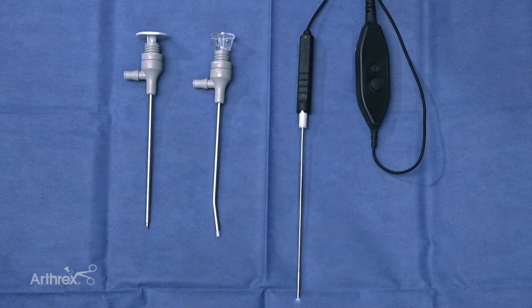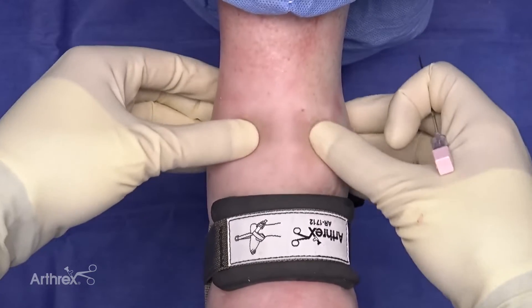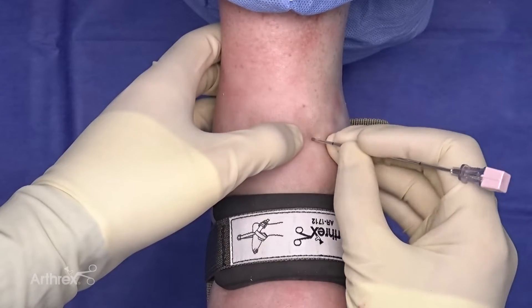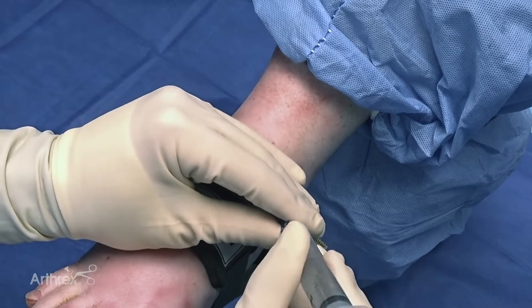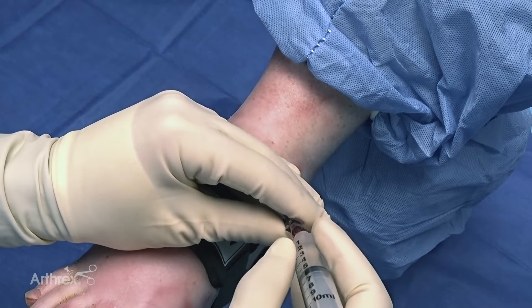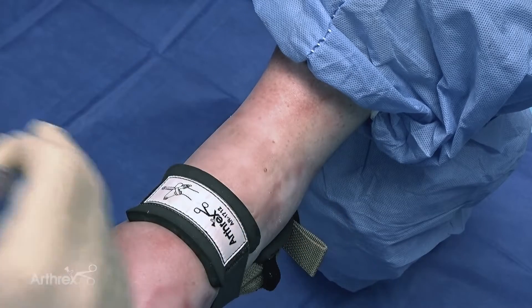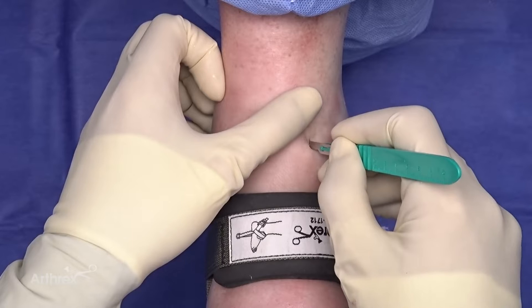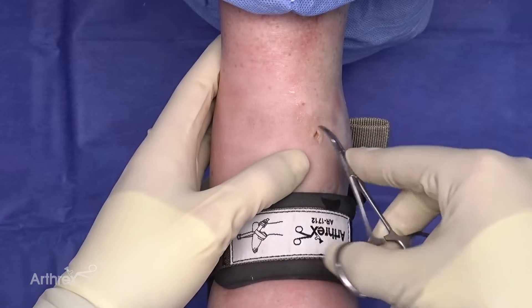Now we're going to transition over to the ankle. So to make my portals, I feel for the tibiotalar joint. I feel where the tibialis anterior tendon runs and stay just medial to that. I'll insert a needle into the joint, and then I'll insufflate the joint with some saline. Remove the needle and make my portal. I'll use a stat to dissect down into the capsule.